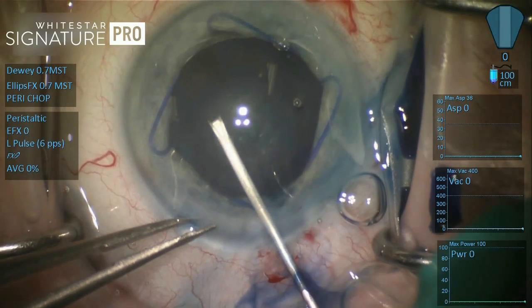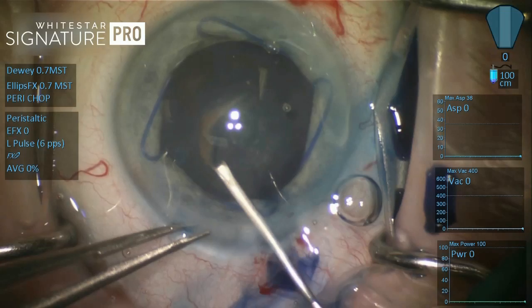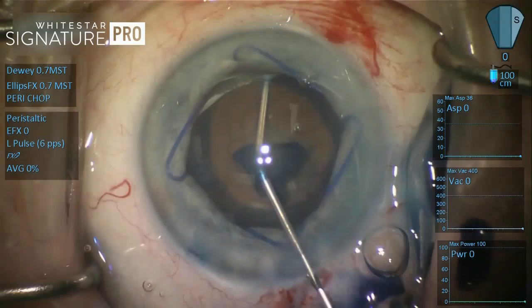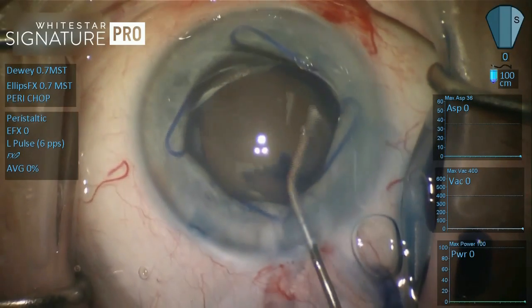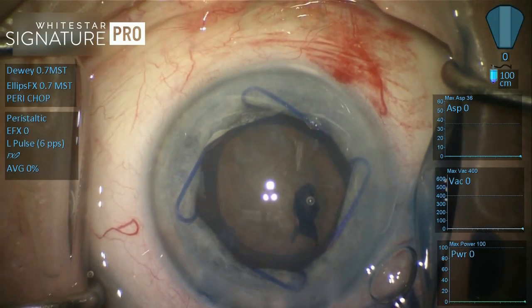So we're going to use a bent needle cystotome here, and we're going to perform a capsulotomy. And we're not as worried in these really dense cataracts about maintaining the edge of the rhexis over the edge of the optic. I think we're going to be fine here. We're going to hydrodissect the lens. We want to have good mobility of the nucleus within the confines of the capsule for the wrapping of the chopper around the equator of the lens.